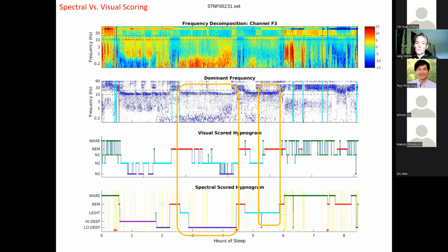And what frequency are they using? They're just looking for the pattern of the slow oscillation. So they're basically looking for massive microvolt changes, and they start tracking it, and then they predict it and give a little stimulation at the exact right time to enhance that drop. Oh, right. Okay.